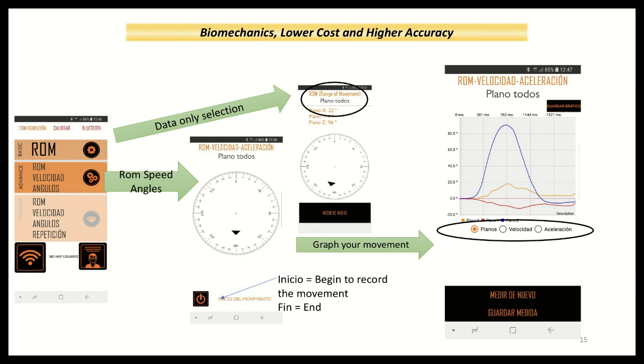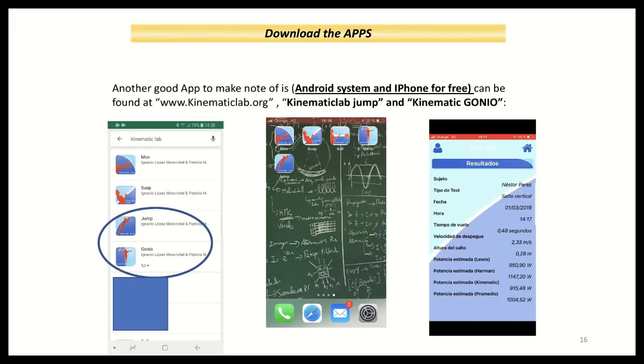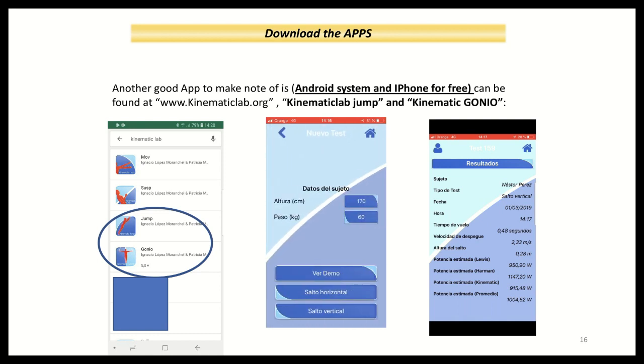Okay? I think the advanced equipment is good to take range of movement, and the other variable is very nice to speak about proprioception with the patient, because the speed tells us what is the correct proprioception that the patient has. Because I can have the same range of movement, but if my left shoulder I move very fast, but the other I move very slowly, I can say that you have an injury in the proprioception of the right shoulder, okay?